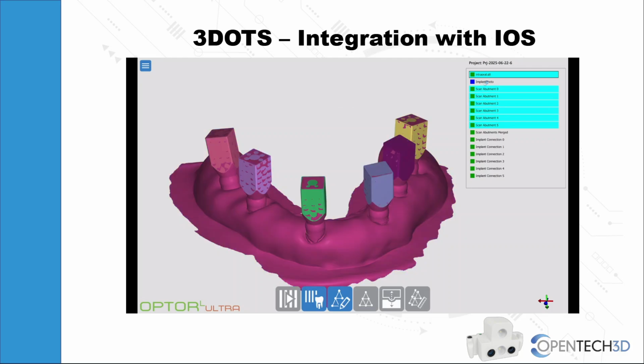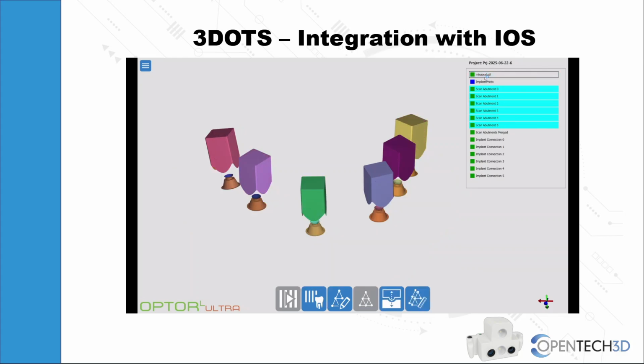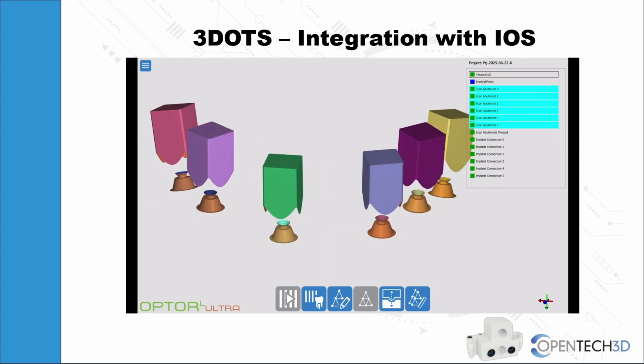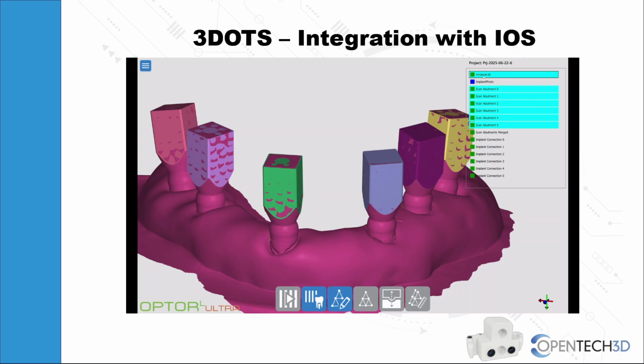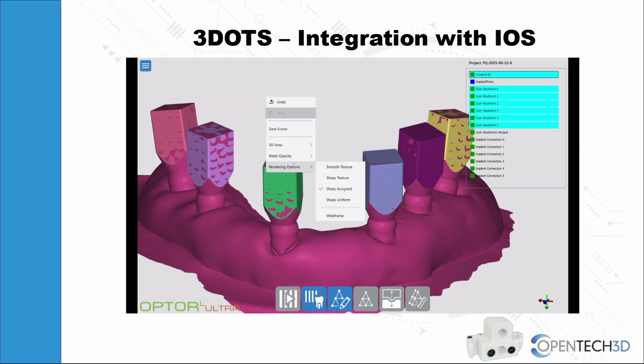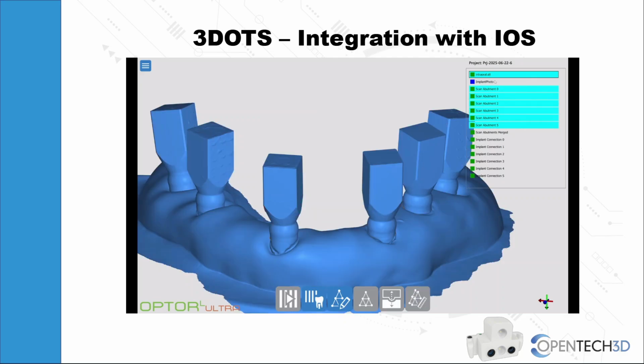Once the work is finished, we are ready to export it to CAD. During the export phase, the software replaces the implant positions that we got from the scan done with the intraoral camera with the implant positions acquired through photogrammetry. So, in the CAD, I find all the data coming from the intraoral camera in terms of tissues, adjacent, antagonist, and so on, but I work on the implant positions that are provided by photogrammetry.